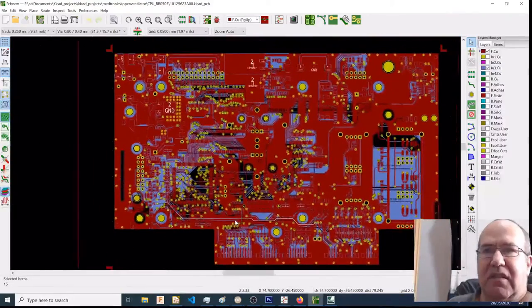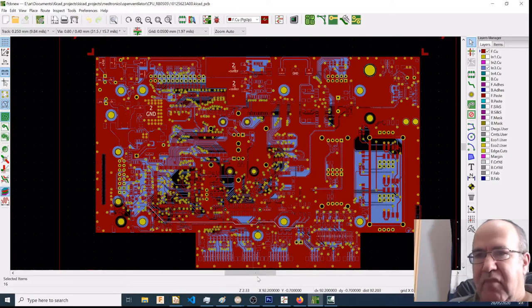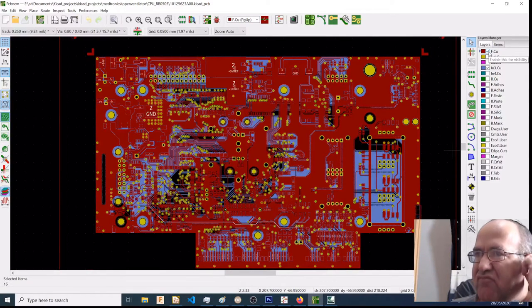The problem is 24 volt util is on the opposite side of the board. I'm going to come back to the 24 volt util in a few seconds, but you'd have to take a trace all the way across the board, a relatively thick trace, to the other side of the board for 24 volt util. Or I would take it around the side, as we have a 24 volt plane. On the outside, we can take the 24 volt to the O2 valve.